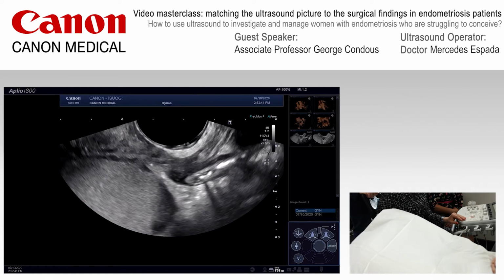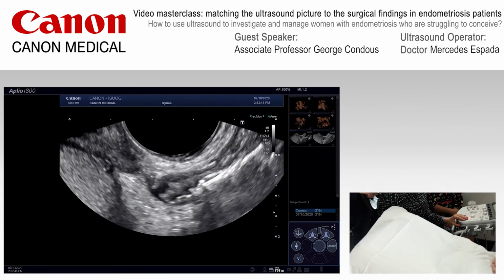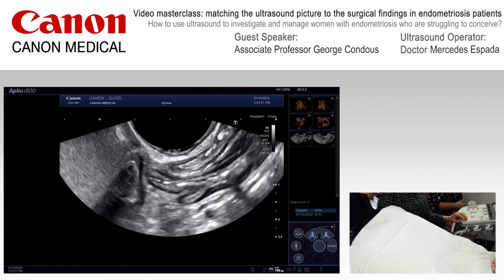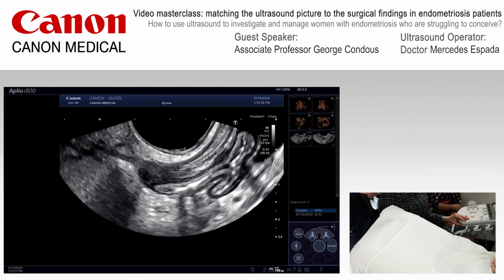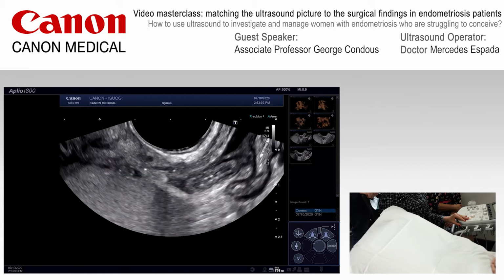And if we go back to that rectal nodule, you'll see that, according to the IDEA consensus, you can see that almost concertina effect as the bowel is drawn towards, you'll see that layered effect. So as the rectum itself is drawn towards that lesion, so you get that pulling of one's sleeve sign that's described in the IDEA consensus statement. There's a really nice view of that there.